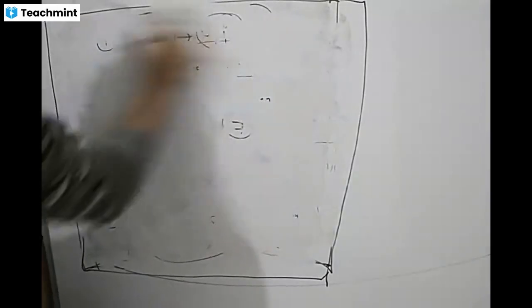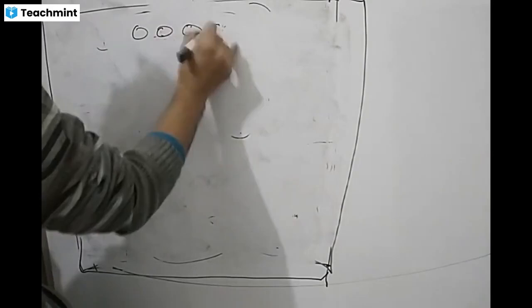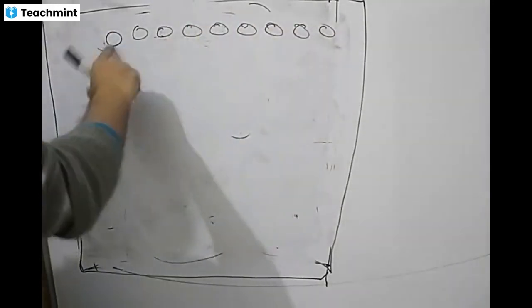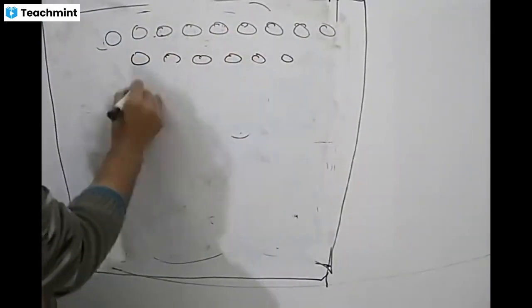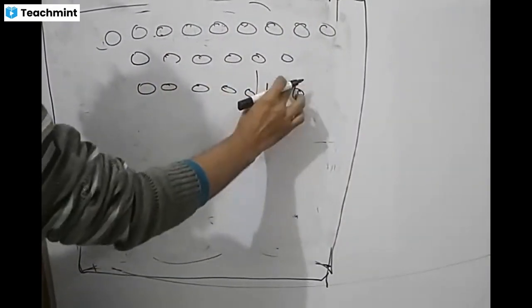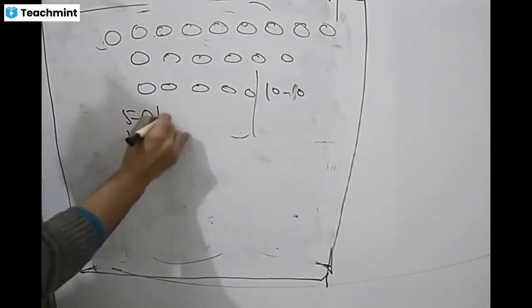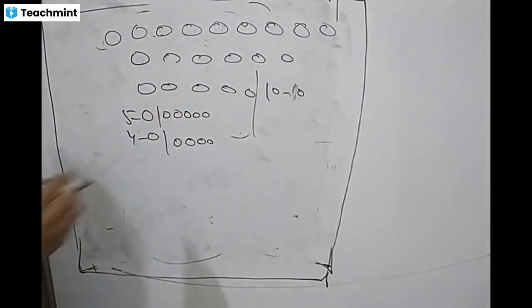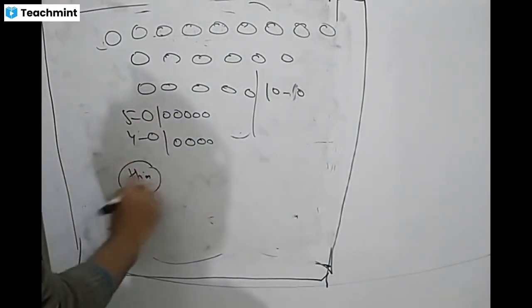The meaning of 12-0 or 7 is itself interesting. If you make 0 like this, 12-0 means there are 12 zeros, or we simply write 10-0. Similarly, we have 5-0, 4-0. The more zeros you add, the finer your material becomes.